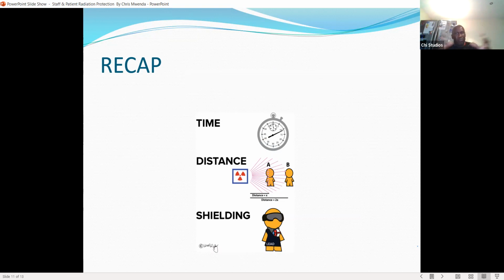So what we usually advise is that there's some, maybe in CTO, that's a chronic total occlusion, because you want to see the backfilling of the heart, you take longer acquisition. Some people, they will take a picture, they can see the vessel, but they keep on acquiring until the dye disappears. That's not necessary.